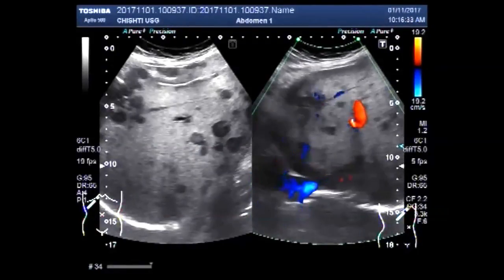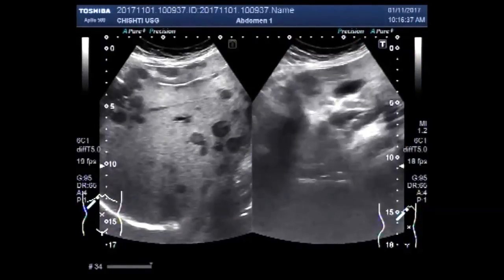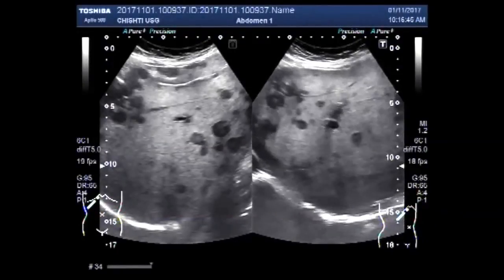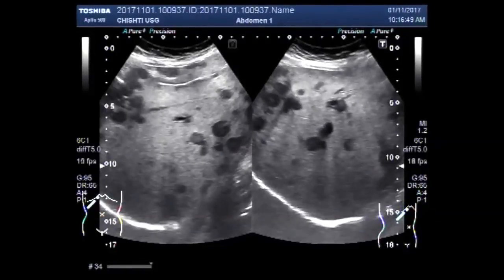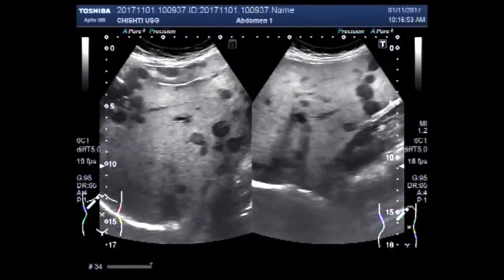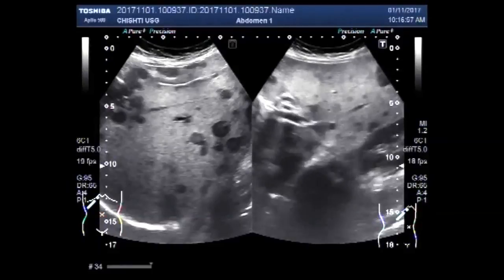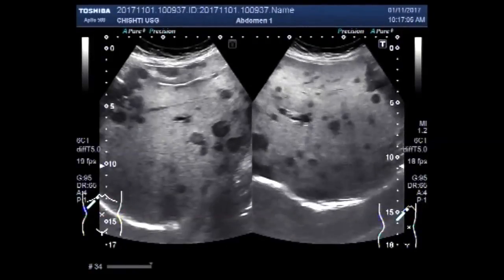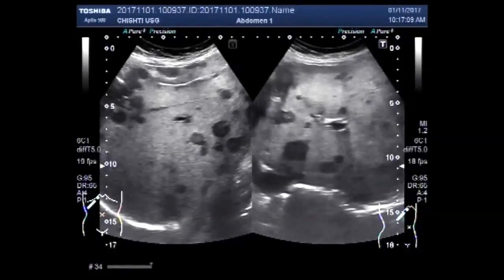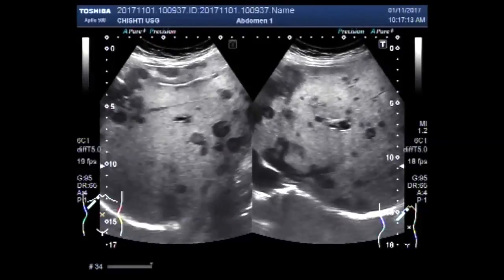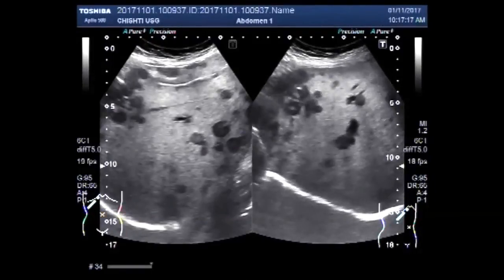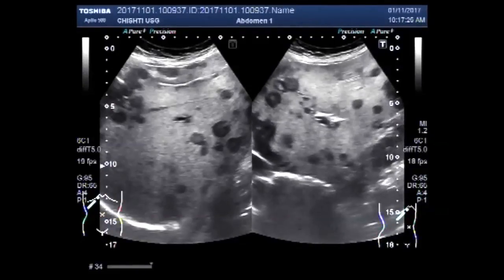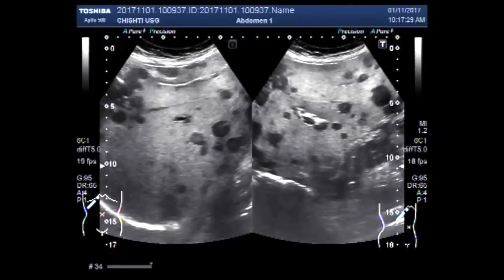You can see the blood flow. The patient had no ascites and no other abnormality on ultrasound.